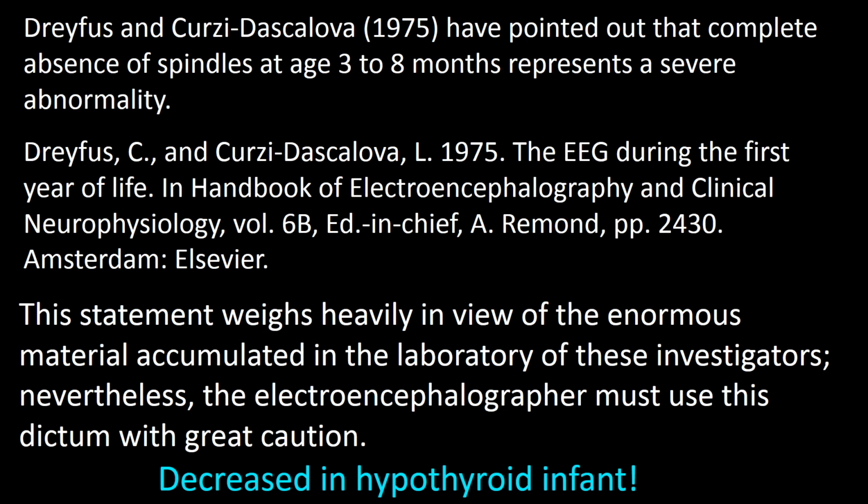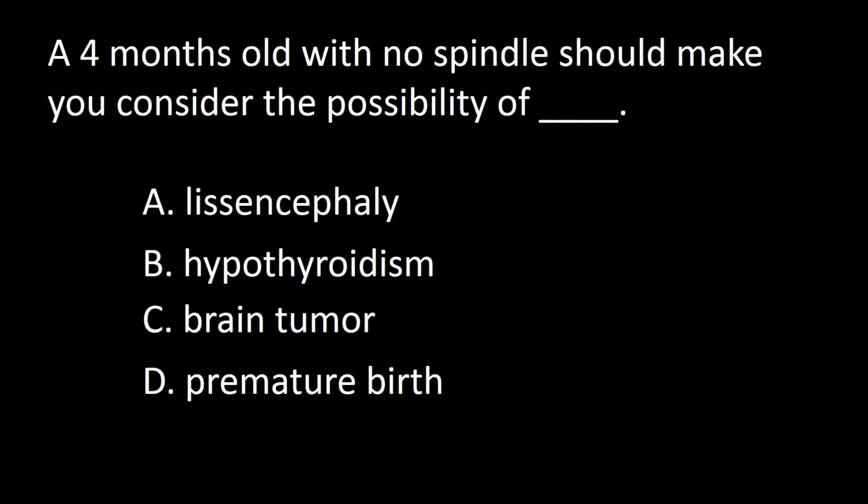Having said this, one disease that should not be forgotten when no spindles are present is the possibility of hypothyroidism. So the answer to this question is B.